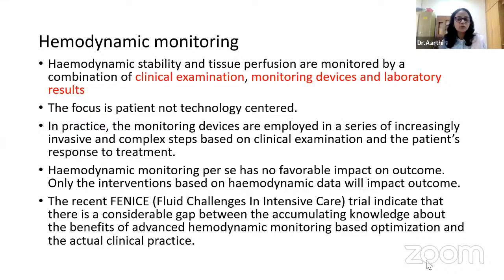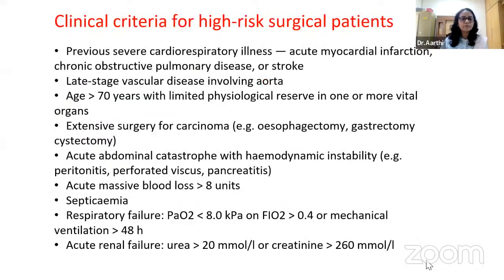The recent fluid challenge and intensive care trial indicated that there is a considerable gap between accumulating knowledge about the benefits of advanced hemodynamic monitoring based on optimization and actual clinical practice.